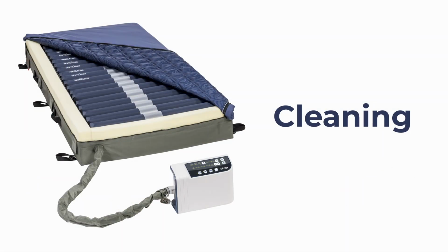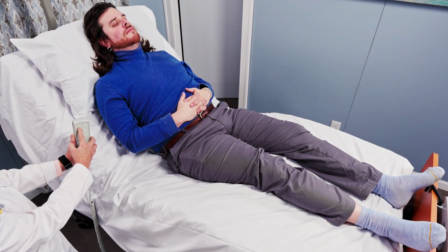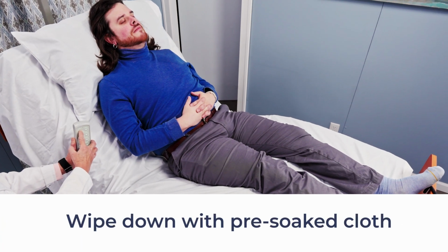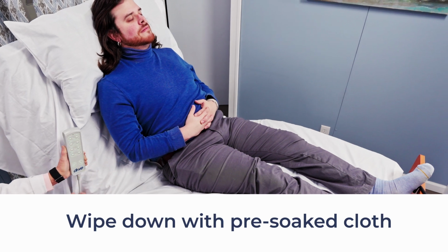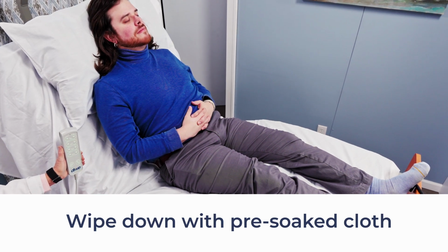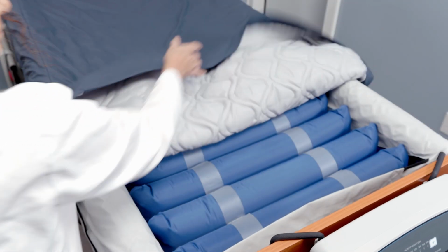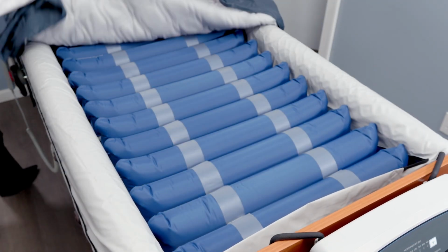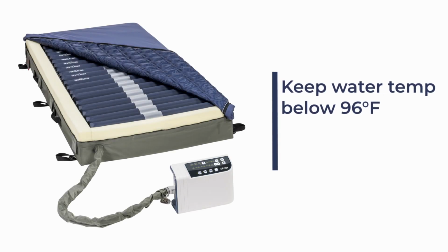Now onto cleaning your Preserve Tech MedAire Edge system. For general cleaning, for example, when the mattress is in use for the same resident, simply wipe it down with a damp cloth pre-soaked with warm water containing a mild detergent, 1 to 10 chlorine bleach, or a quaternary cleanser. If needed, the mattress top cover can be completely removed and laundered. Please keep the water temperature below 96 degrees Fahrenheit and allow the cover to air dry before zipping it back onto the mattress.